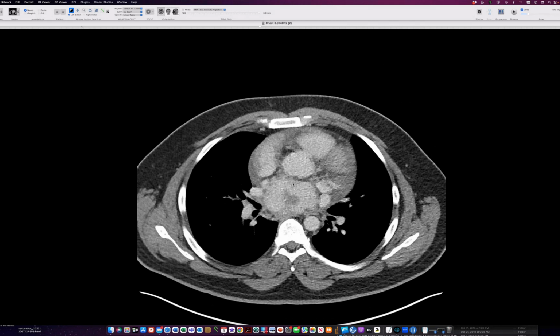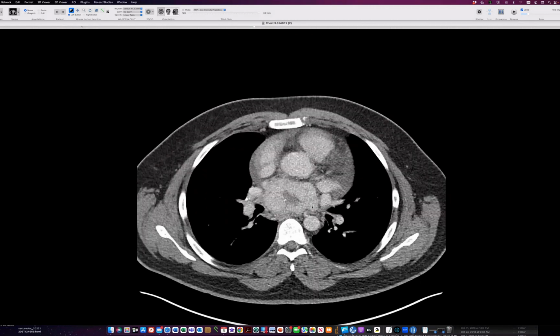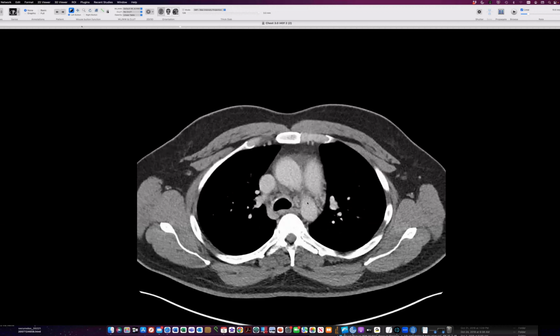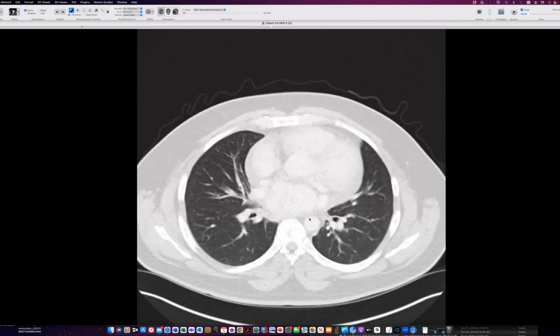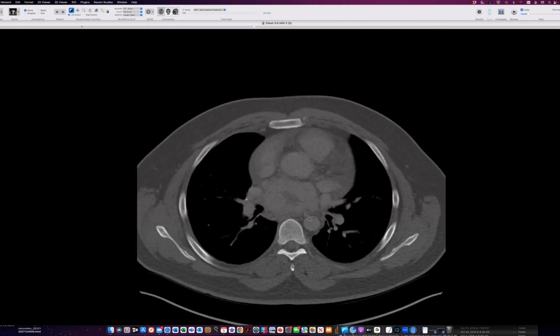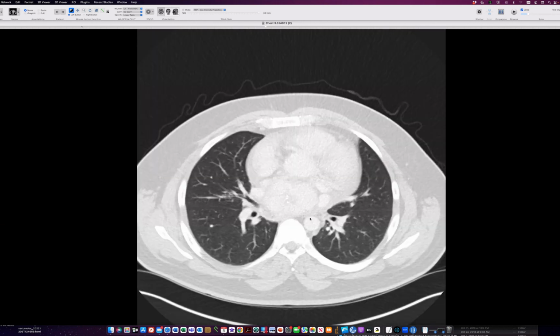So what do you think? Very vascular lesion. Before they resected this lesion, they did a lot of embolization procedures. IR did that. Looks like a paraganglioma. Paraganglioma, or okay, vascular malformation. Or indeed a paraganglioma. Yes. And this thing lit up nicely on a DOTA scan, but I can't show you that because it's not anonymized. So can you show this on a sagittal recon?